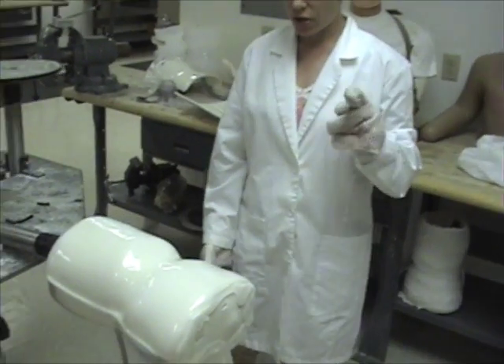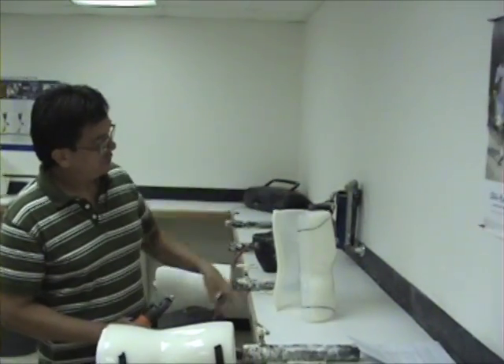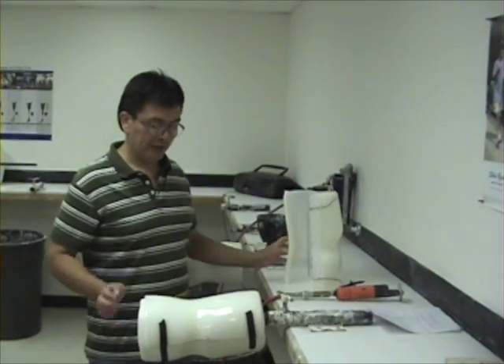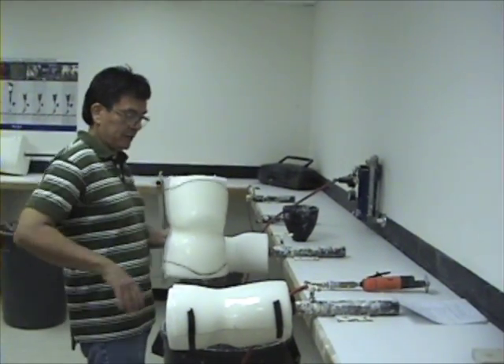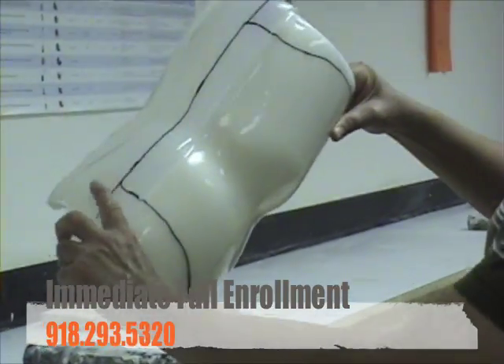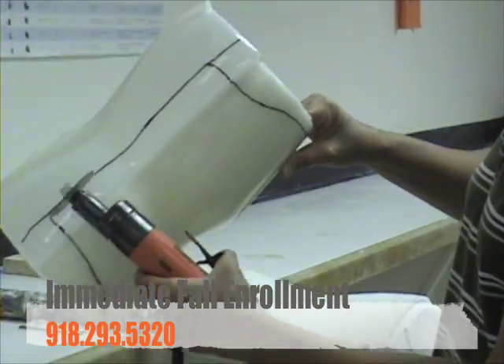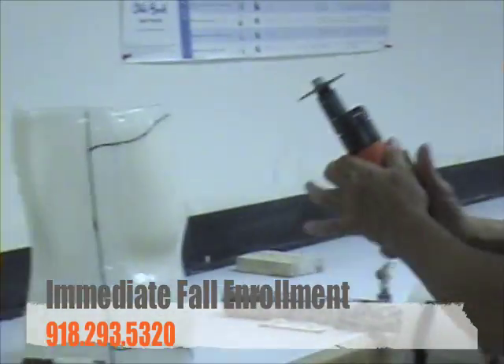We just vacuum-formed and thermo-formed the anterior half of a bivalve TLSO to form this spinal orthosis. It has an anterior side and a posterior side that fits on the mid-torso part of the body. The landmarks were drawn, and that's where I'm going to use this cast saw to cut along here to form the arc.